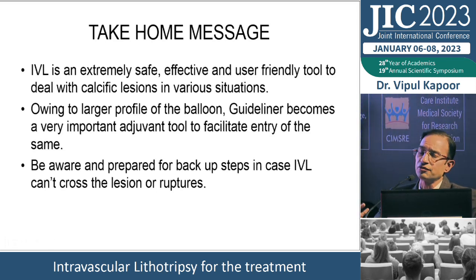But in that case, you have to be prepared because these are all complex cases. You are in any case prepared for any eventuality. But with IVL, life has become so simple for interventional cardiologists, and we have started to adopt it for most of our patients who can afford it, for calcific coronary artery disease.